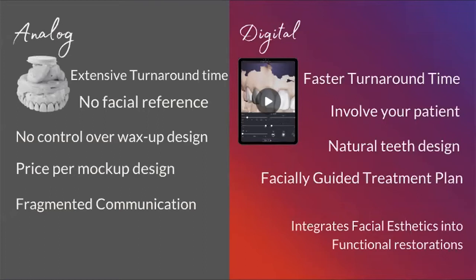So as of now, we have here 50% of you guys outsource them to your dental lab. 25% of you guys create yourself digitally. I wonder if you guys are already smile designers from SmileFy. I'll ask you guys later, okay? But I see here that 11% of you guys create your own dental wax-ups, but in the analog way, and 11% want to start doing wax-up trials in your own practice.